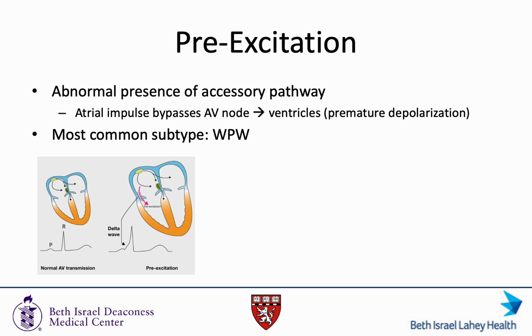The shortening of the PR interval results from the fact that most of these AV bypass tracts conduct rapidly, similar to working atrial and ventricular myocardium, and not with the delay incurred by conduction through the AV node. The delta wave results because ventricular activation adjacent to the insertion of the bypass tract is slower than normal initial activation of the ventricles through the His-Purkinje system.